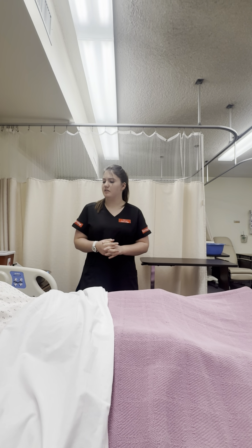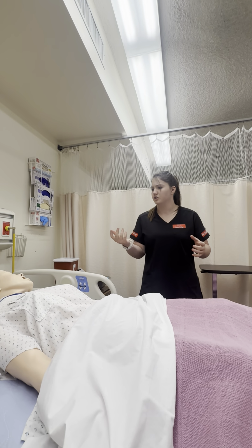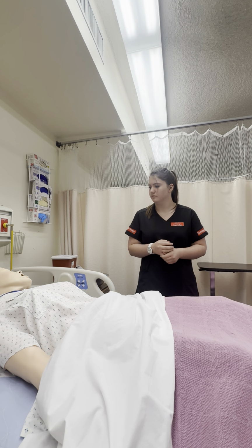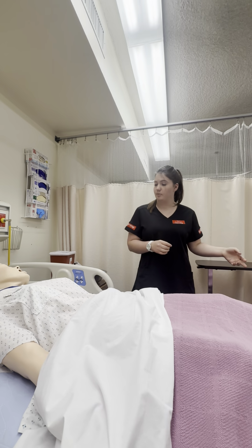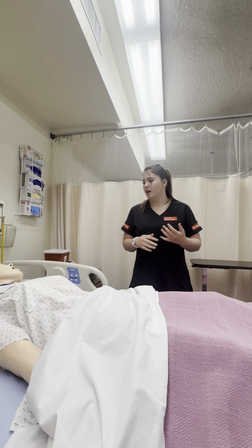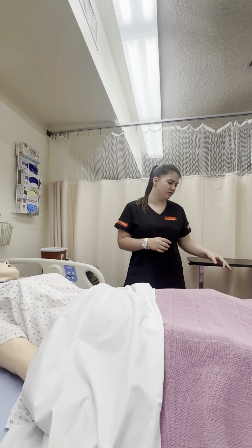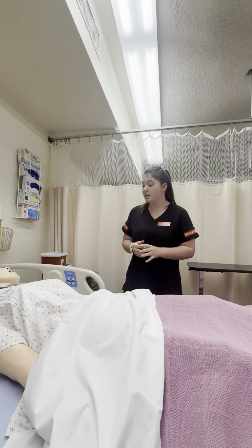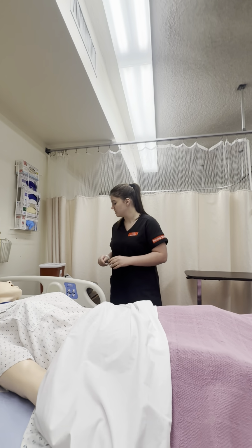Okay. And the catheter hasn't caused you any sort of discomfort upon insertion or any time after you've had it? I mean, it wasn't comfortable at first, but I think that now I get used to it. It's fine. For sure. Okay, good to hear. Have you noticed, we've been documenting your output pretty regularly, but have you noticed yourself any sort of bleeding, mucus, or any characteristics about the urine in your urine bag? No. No, not at all? Okay. We keep a pretty thorough record of that when we change out the urine, but I just thought I'd ask you just to make sure.